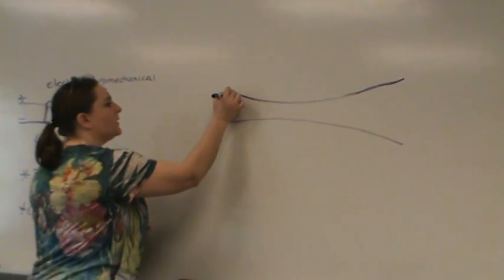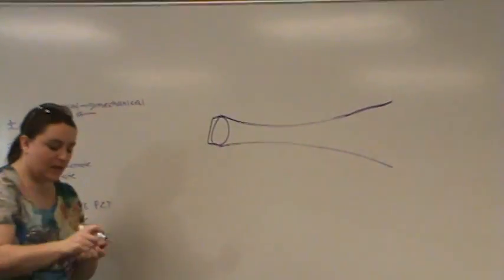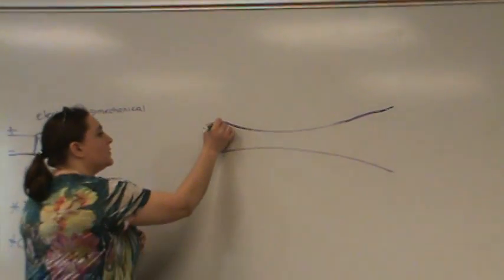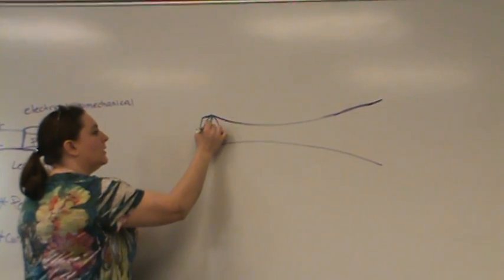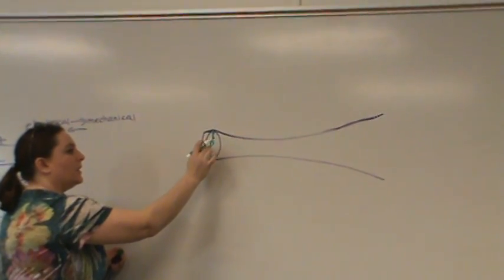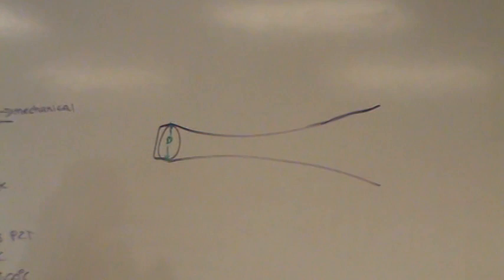So this little piece right here is supposed to represent our transducer, and it has a whole bunch of dimensions to it. So it has this dimension here, which is the diameter. So there's the diameter of the crystal itself, and the diameter is going to help determine beam shape and where the focal zone is and how narrow the focal zone gets and how close the focal zone is to the transducer face or how far out it is.